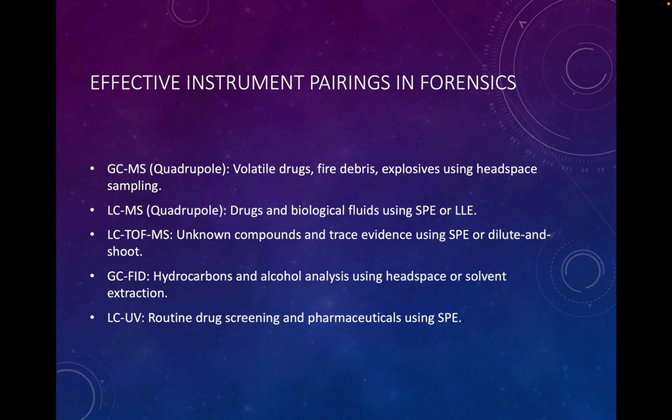Effective instrument pairings. To summarize, GC-MS with a quadrupole analyzer is ideal for volatile drugs, fire debris, and explosives, using headspace sampling, of course. LC-MS with a quadrupole is commonly used for drugs and biological fluids using SPE or liquid-liquid extraction. LC-TOF MS is best for unknown compounds and trace evidence using SPE or dilute and shoot methods.